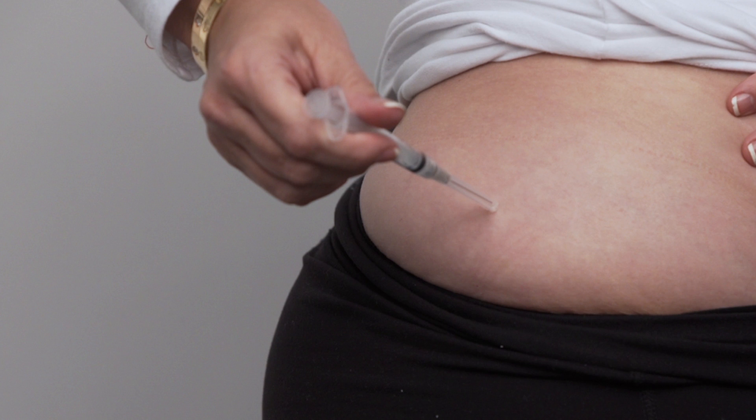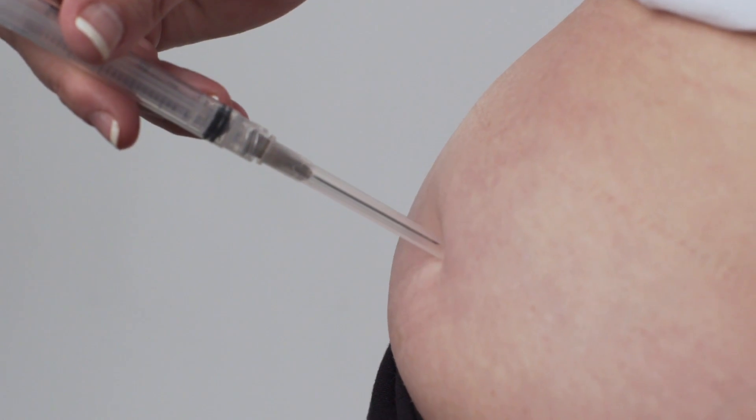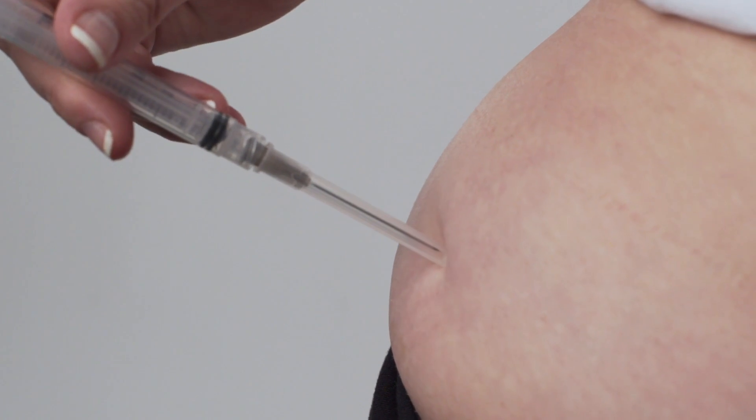You should alternate injection sites each day. Hold the syringe in your hand like a pen or pencil. Use the thumb and index finger of your other hand to gently spread the skin at the injection site. Quickly insert the entire length of the needle at a 90 degree angle. Hold the syringe in your other hand and very gently pull back on the plunger just a bit to check for blood. Do not pull forcefully back on the plunger. If there is blood, you will need to change the needle and start the injection again at a different injection site. This does not happen very often and does not indicate a problem. If there is no blood, push the plunger in a slow steady motion until all of the medication is injected.